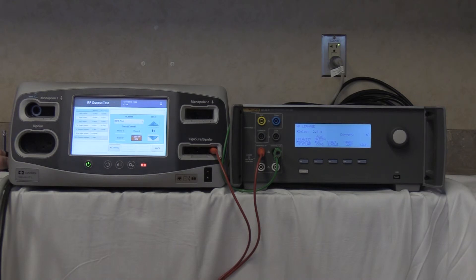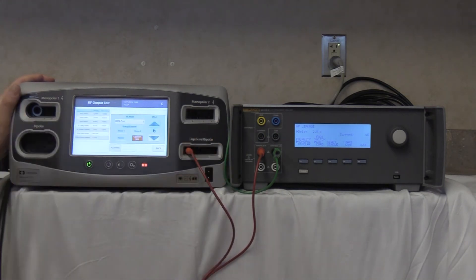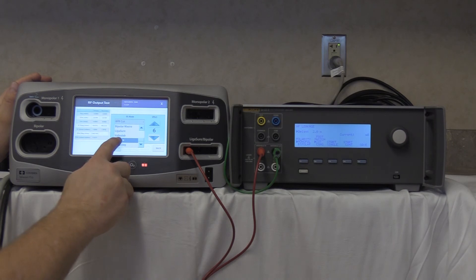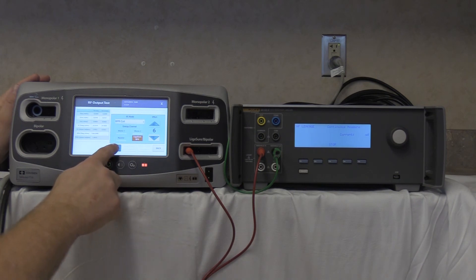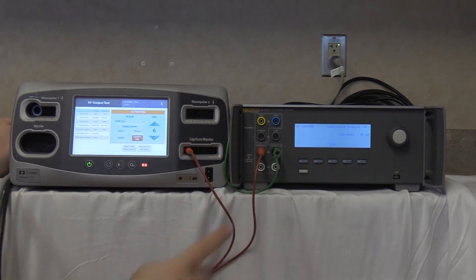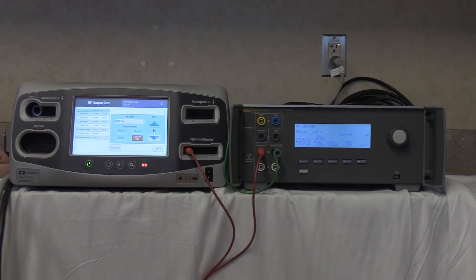Next, connect to the left output line — bipolar resection cut, effect 6. Start continuous and activate the FT10. Our reading is 45 milliamps, well below the 100 milliamp threshold. Deactivate, no-hold, and stop.